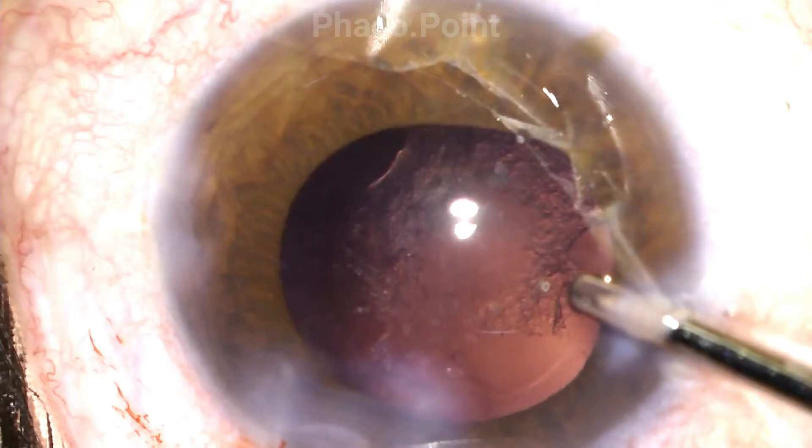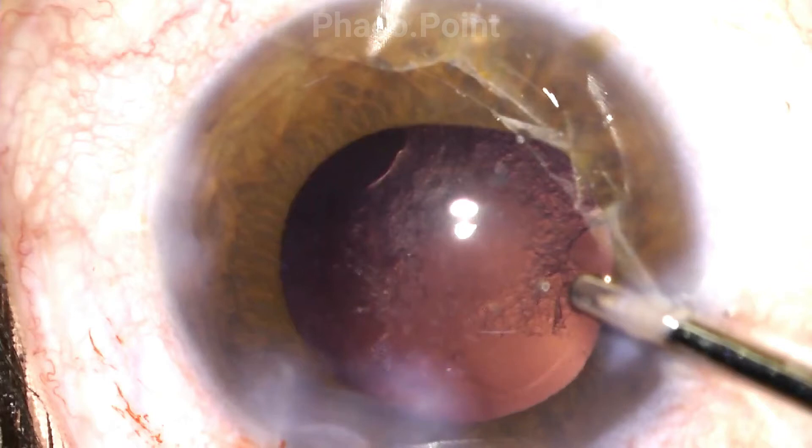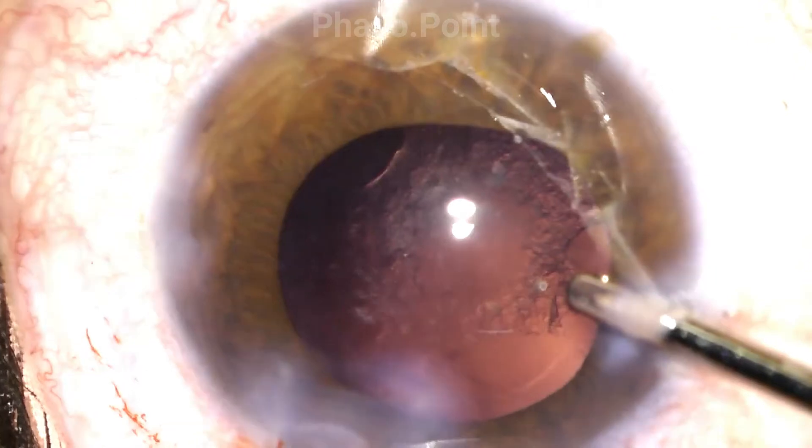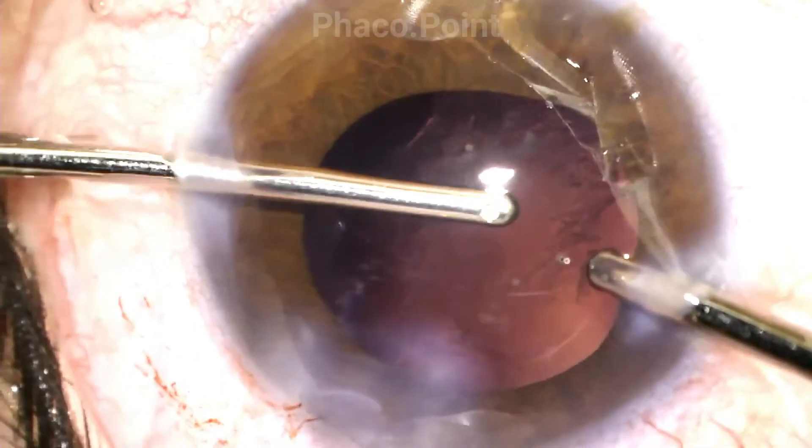The second important point to always remember is to completely insufflate the capsular bag with viscoelastic and attain a perfect focus on the cells lining the posterior capsule, even prior to introduction of the irrigation aspiration cannula. Doing this will help you achieve a perfect focus onto the cells of the posterior capsule, and upon the introduction of the irrigation and aspiration there will be no change in this focus. This minimizes the chances of losing your focus during the posterior capsular polish.